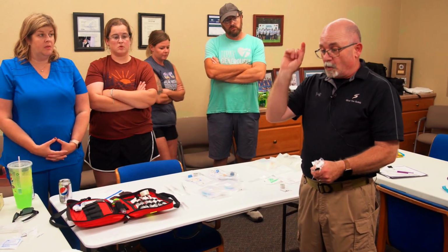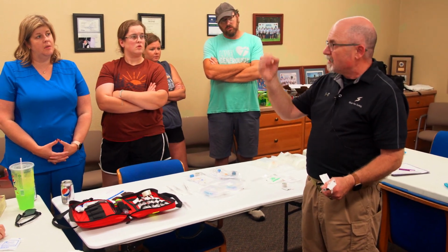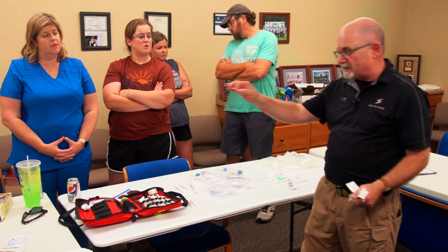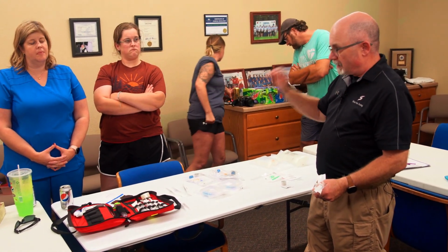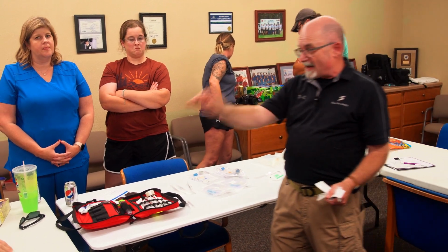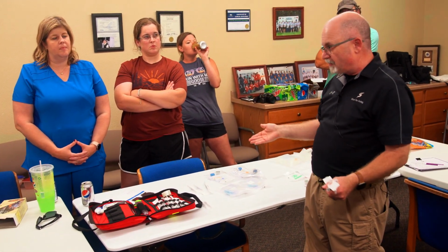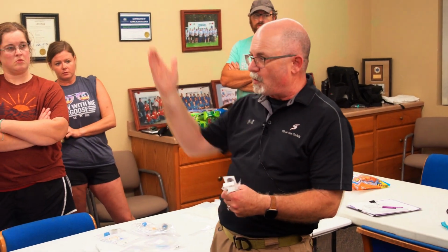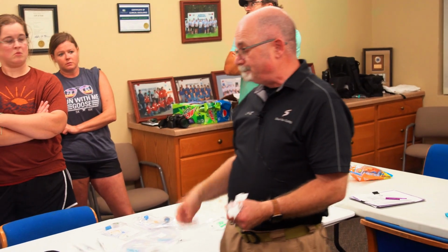Two more things. One, at least from a crew resource management standpoint, every place I've been, we will clarify once the sharps is gone. So I'll either say sharps is on the bench, or sharps is on the counter, or sharps is away, so that the rest of your crew knows that. Or if I do a line and you're driving for me, hey, sharps is away. You still be careful putting your truck back together and cleaning it up, because you forget from time to time, but it's just that one little cross check of, hey, I already got rid of the sharps, so I'm good.